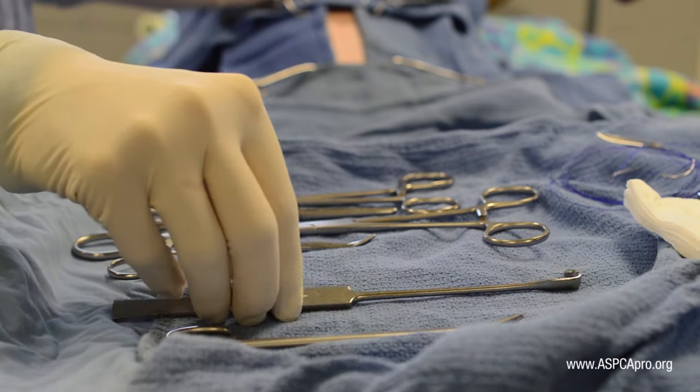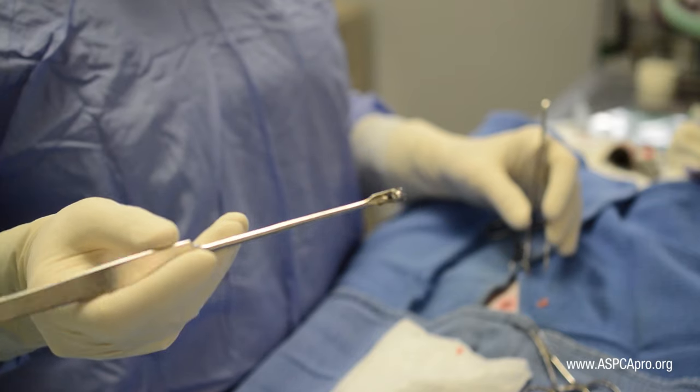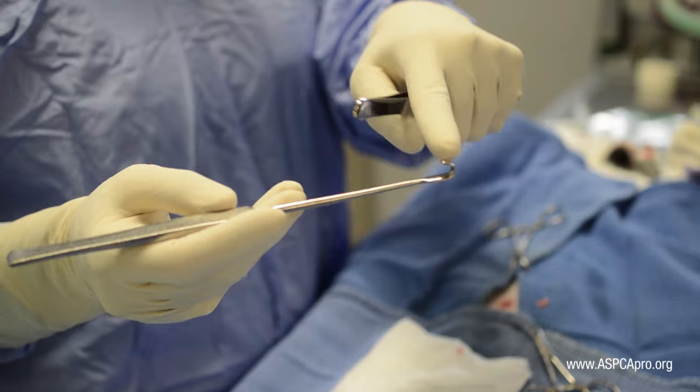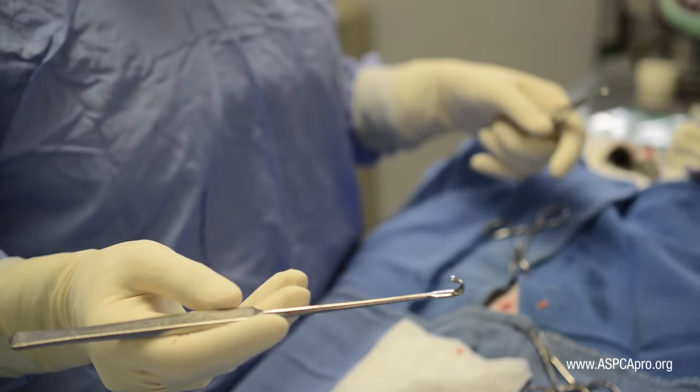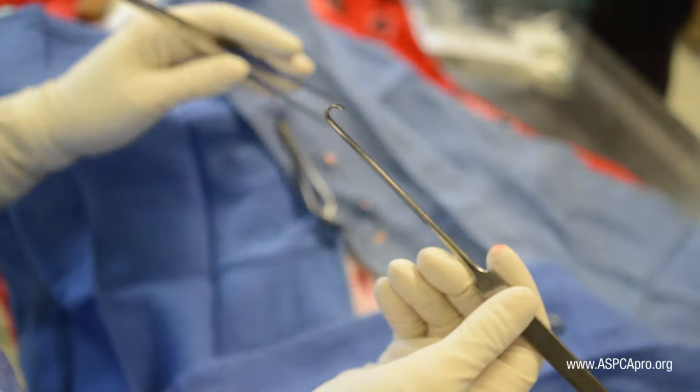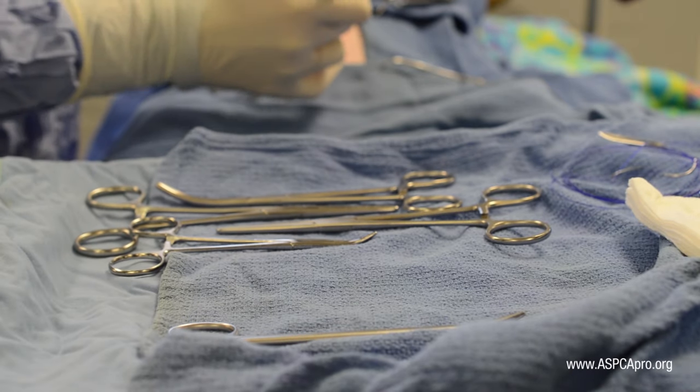When preparing to use the spay hook to locate a uterus, begin by evaluating the hook available. Notice if the curvature of the hook correlates with the narrow or wide aspect of the handle, or whether the handle is round. This is important in order to be aware of the orientation of the hook within the patient.